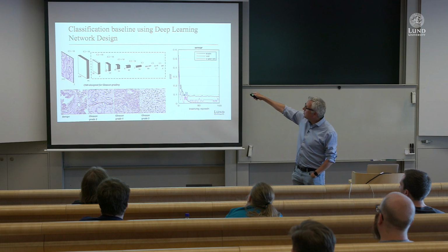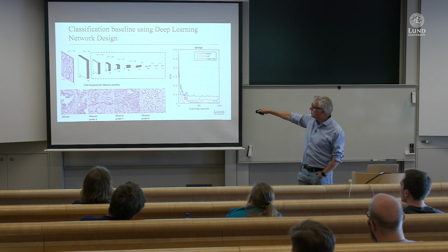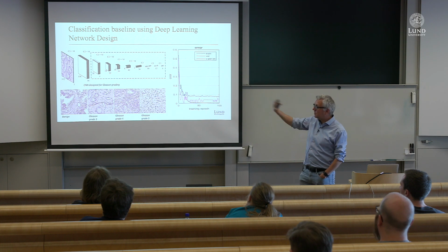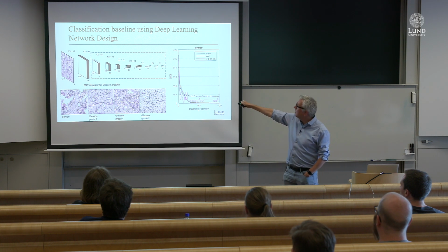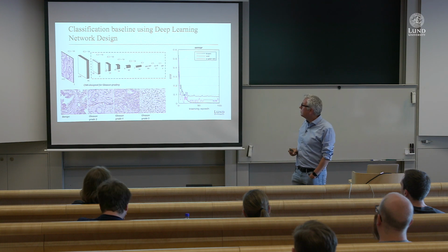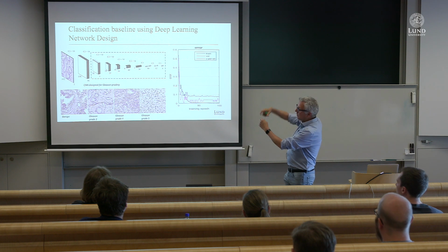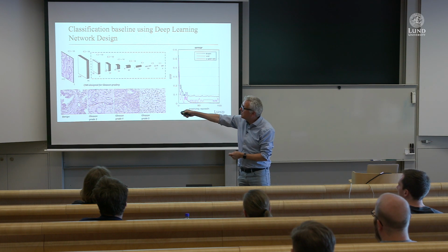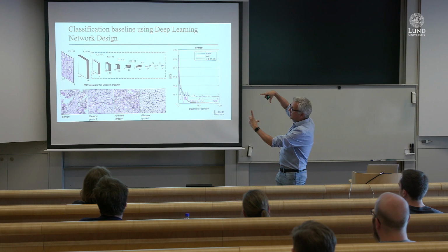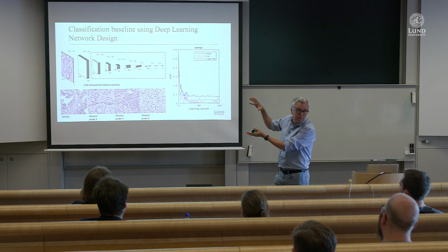Typically, when you optimize, you start out having a large error, and then you get smaller and smaller errors on your training set. But when you then test it on a validation set, you get a slightly larger error, but still no sign of overtraining or anything like that. So quite reasonable. Usually these images which we test on are bigger than these specified cutouts. So given a slightly larger image, which is supposed to be of just one class, you can classify different patches and then let them vote.